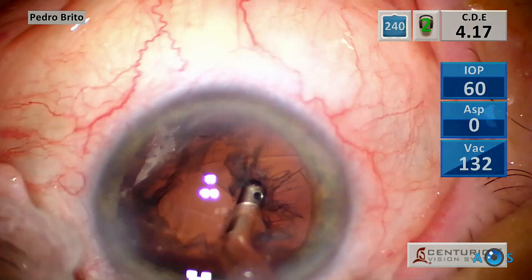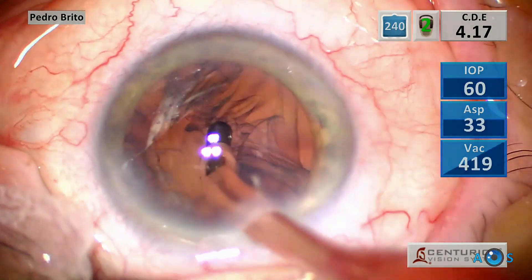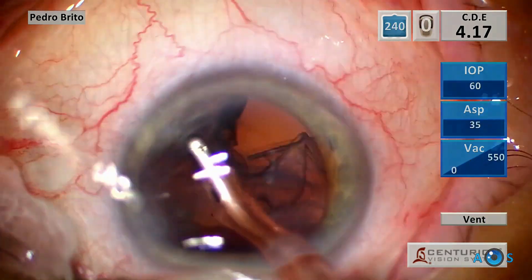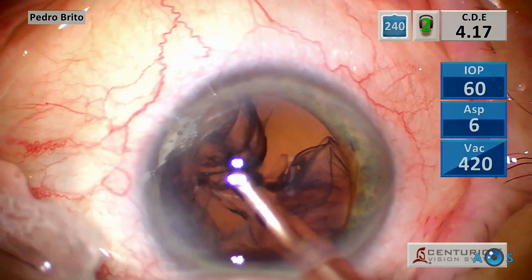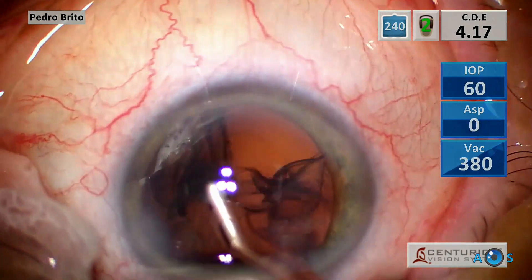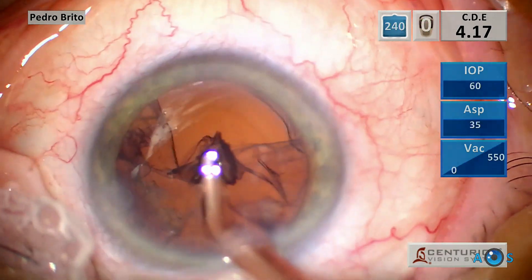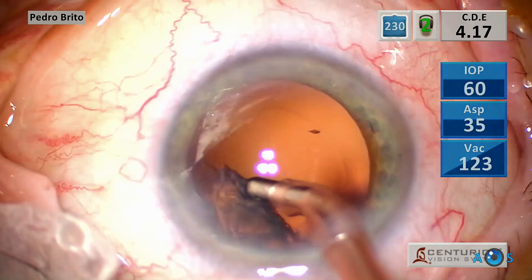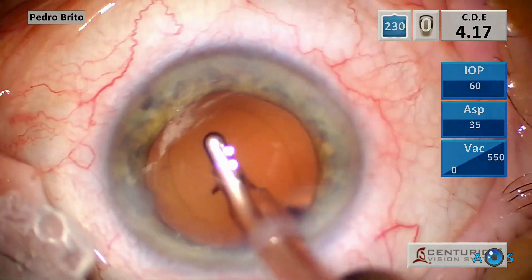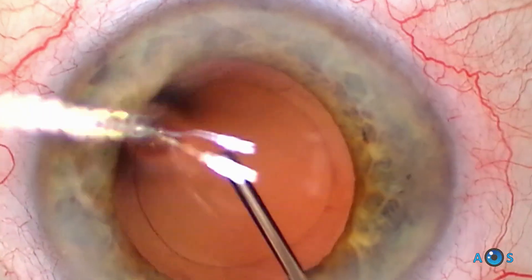Finally, for the cortical removal phase, using the coaxial irrigation aspiration piece, vacuum pressure and aspiration flow rate are increased, and the working IOP is also slightly increased. The cortical material is fully aspirated, and you can see a very nicely clean capsular bag.